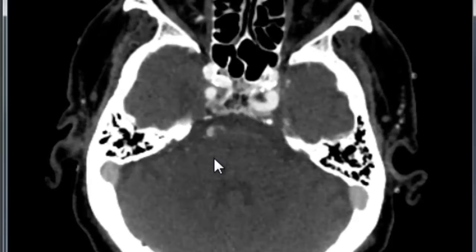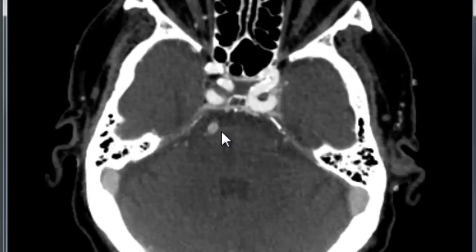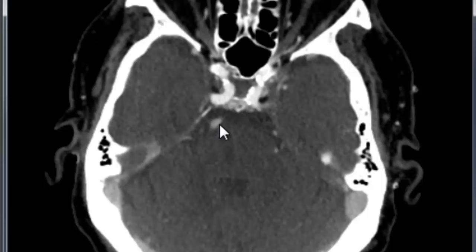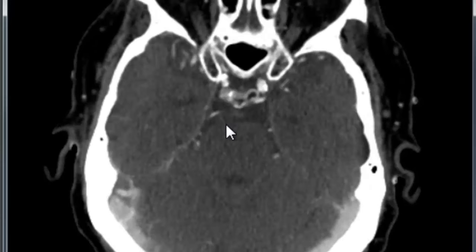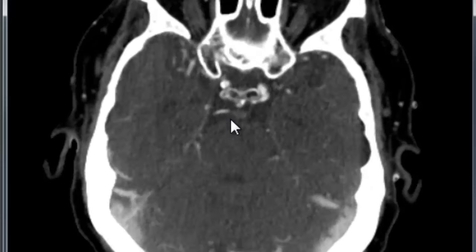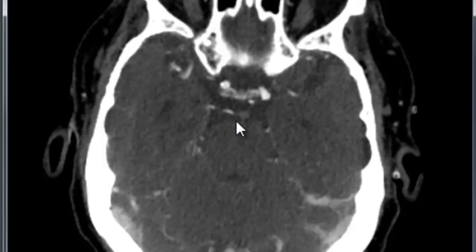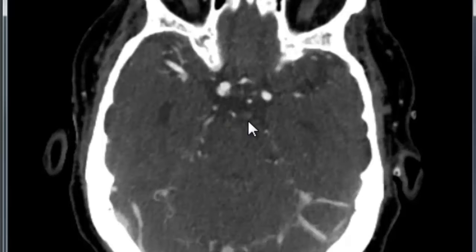We'll see why shortly. As we come up farther, we see the basilar about midway stop, and we no longer see contrast opacification. Here's the unopacified basilar artery in cross-section.